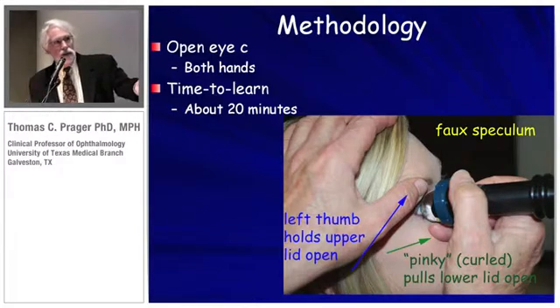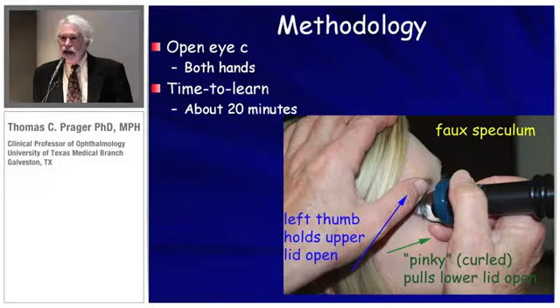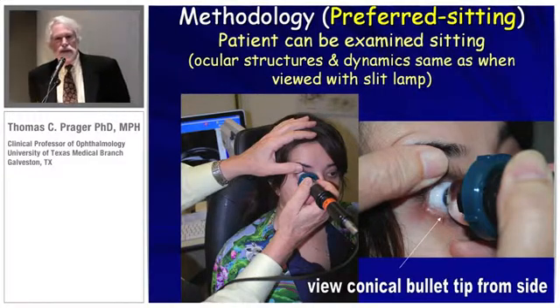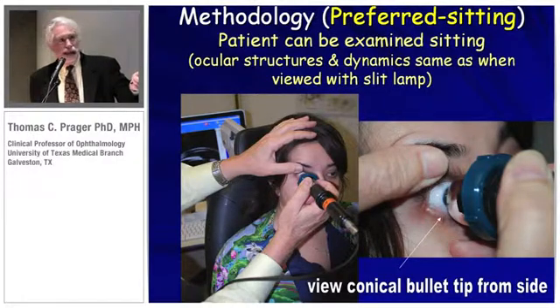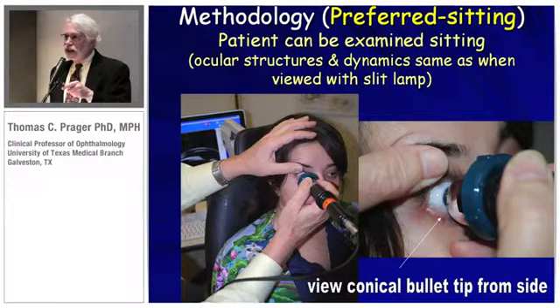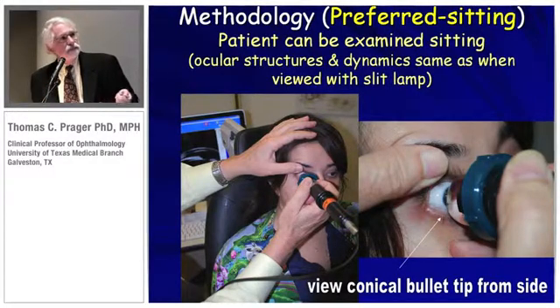I'm going to take this conical bullet and aim it right into the center of the cornea. If I need to make an adjustment, the skin is very pliable — I can move up or down, left or right, just a few millimeters, and I can always capture that open pupil. As Dr. Garcia was pointing out, it's possible for the iris diaphragm to fall backwards in the supine position. I prefer examining the patient sitting up, because that's the same way you're going to see the patient at the slit lamp. I can also see around the collar more easily, and I aim the bullet tip right into the center of the eye and then move over to the side.